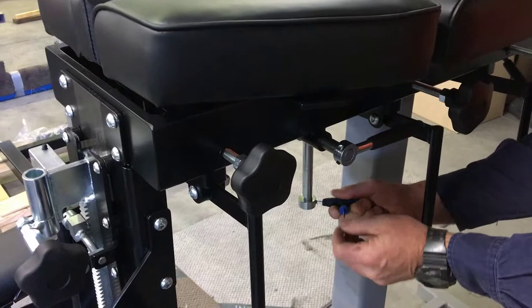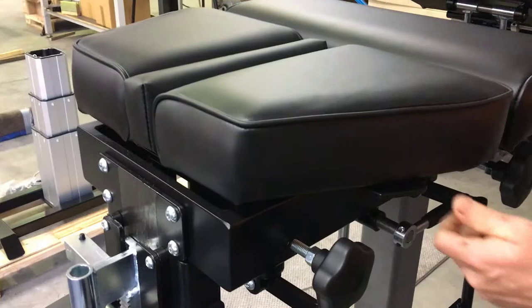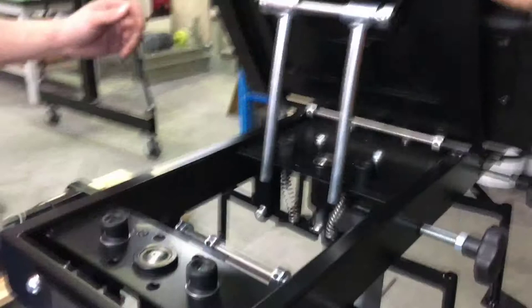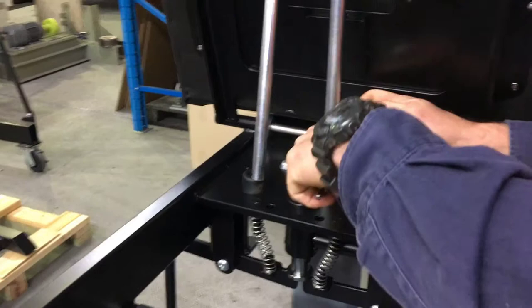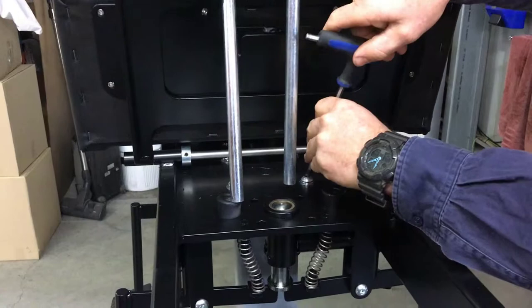The next step is to remove the locking nuts to allow the table to come up completely so we get access to the bolts. Once it's up to its full length, you get easy access to these two bolts. Make sure you've got sufficient leverage and loosen them counterclockwise.